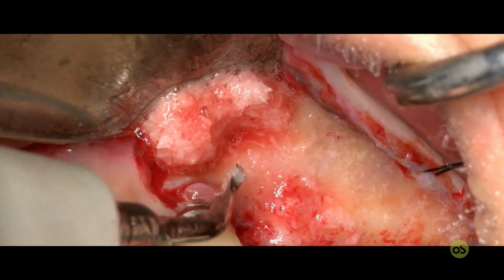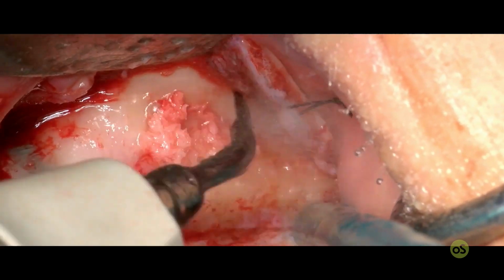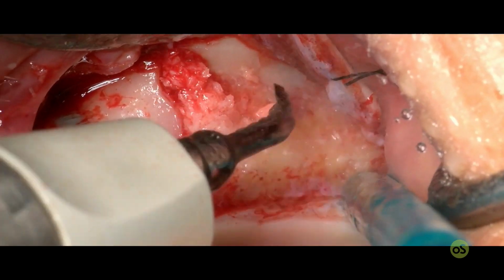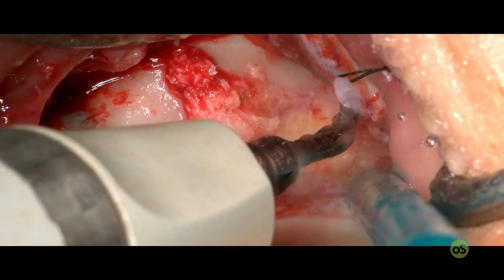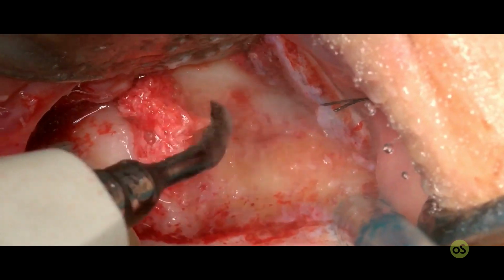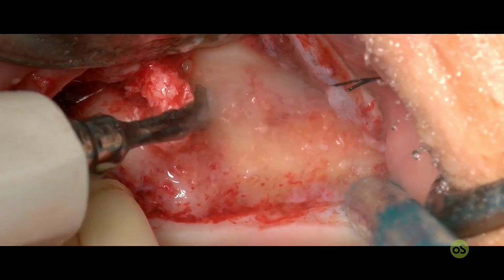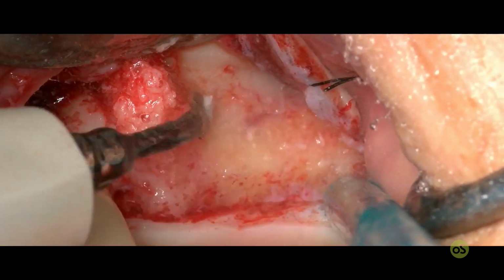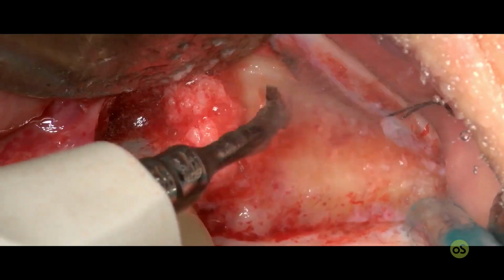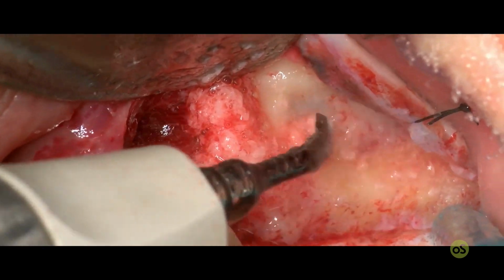Another important consideration is the position of the tip of the suction, which is in the distal part of the flap, and the assistant maintains this suction in contact with the bone in order to reduce the quantity of saline solution, in order to maintain all the debris, all the particles together, because we want, at the end of the surgery, to combine the autogenous bone with the xenographic material.